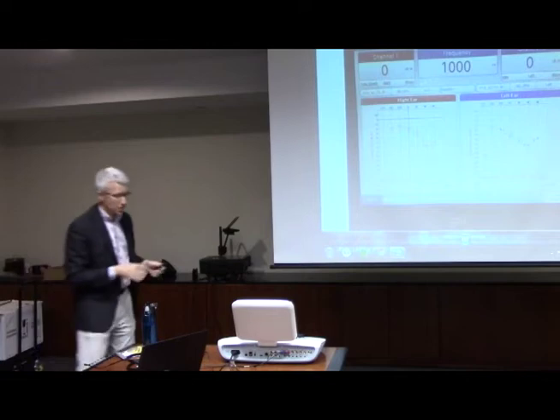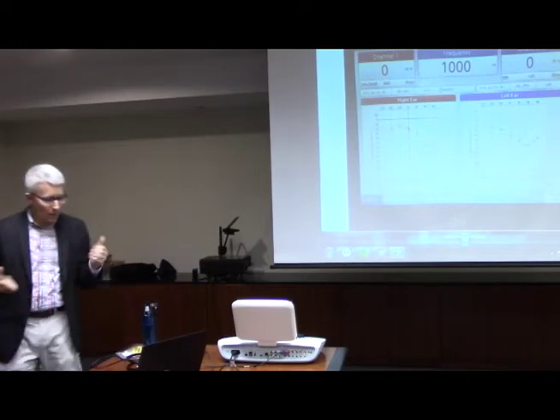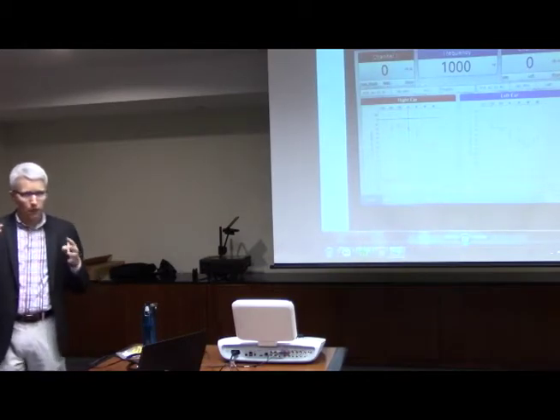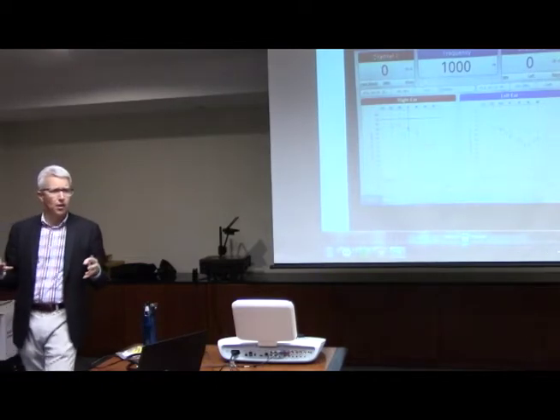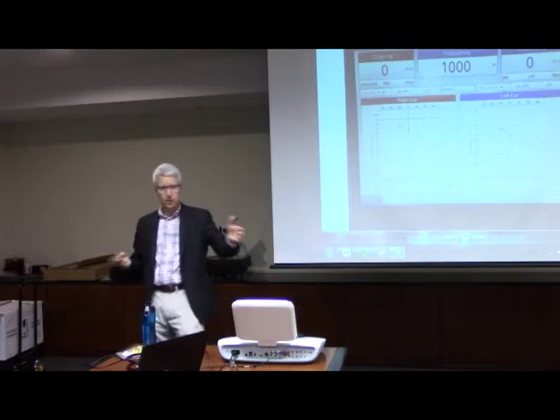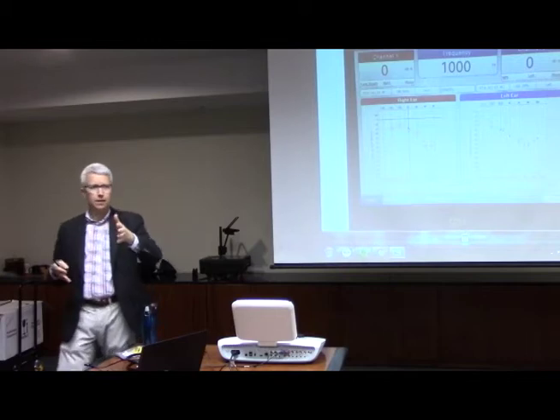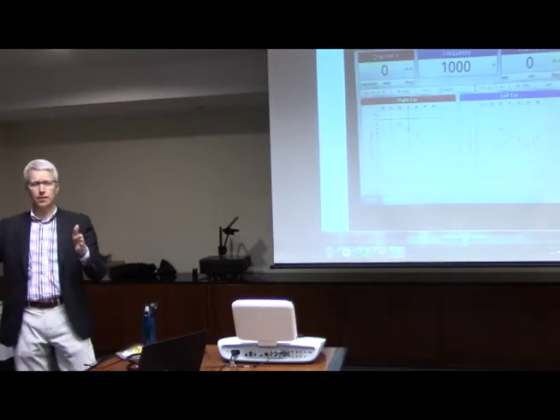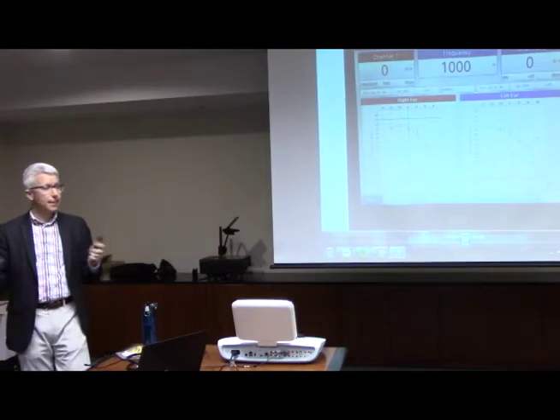Okay, so I mentioned the different tones that come out of here, and that's how we do a hearing test. The patient responds. There are a variety of different types of tests and different components of tests too. So we have what I just did here, that's called a pure tone. So it's one frequency. Testing starts basically at middle C on a piano and then goes up 6 octaves from that. And we do some of the inner octaves as well. That's just kind of the standard hearing test.